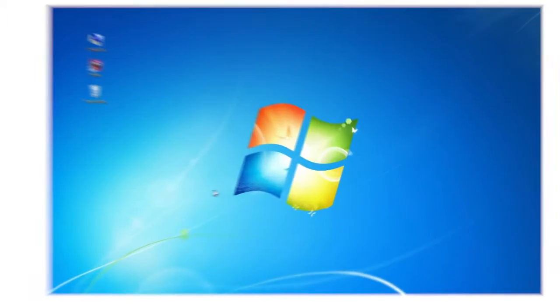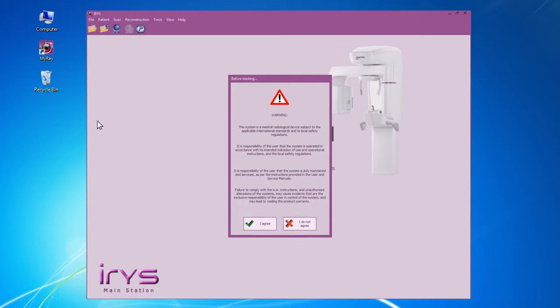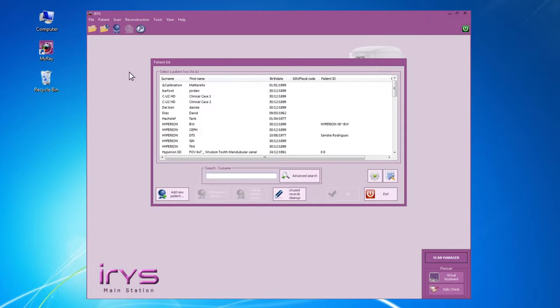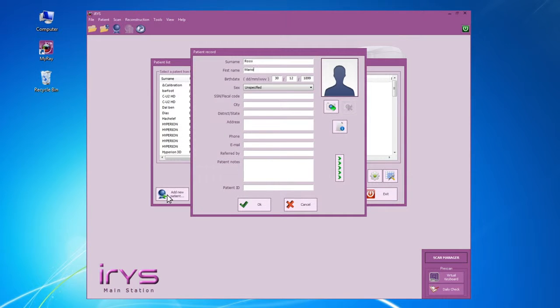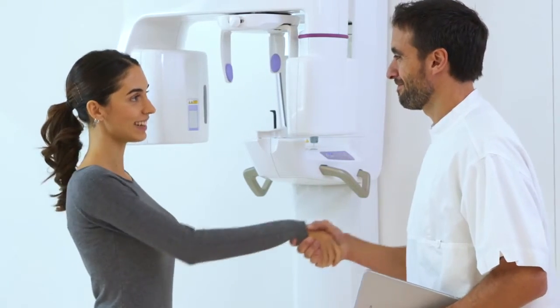First of all, launch Iris by clicking on the desktop icon. Before the examination, the dentist selects the patient's personal profile from the database. Then he chooses an examination protocol on the virtual console available on PC and iPad.